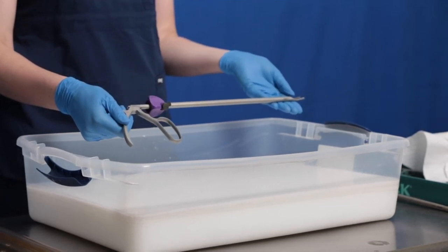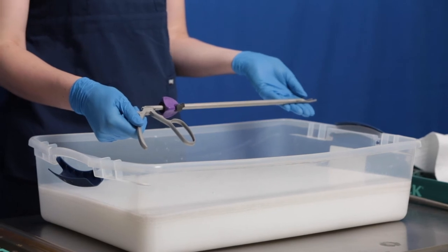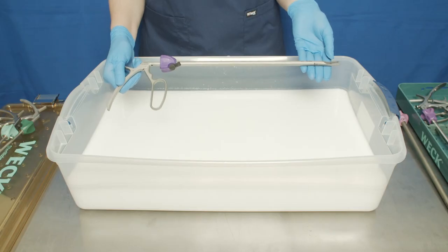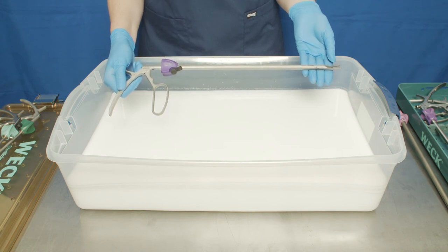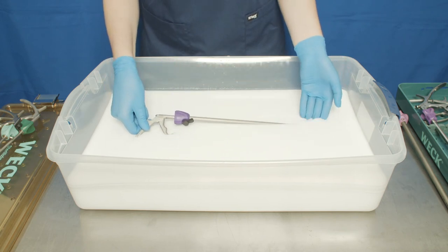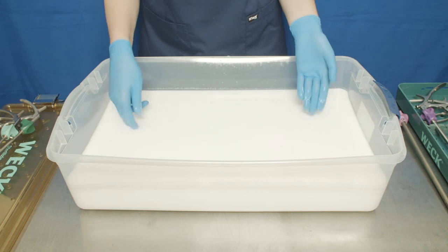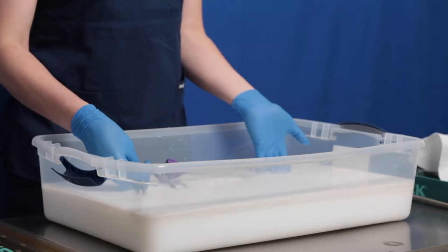There are multiple ways to lubricate and it is important to follow the lubrication manufacturer's guidelines. One manual lubrication process example is to take the device and submerge it into the lubricant for 30 to 45 seconds. Then withdraw it and prepare it to be sterilized.